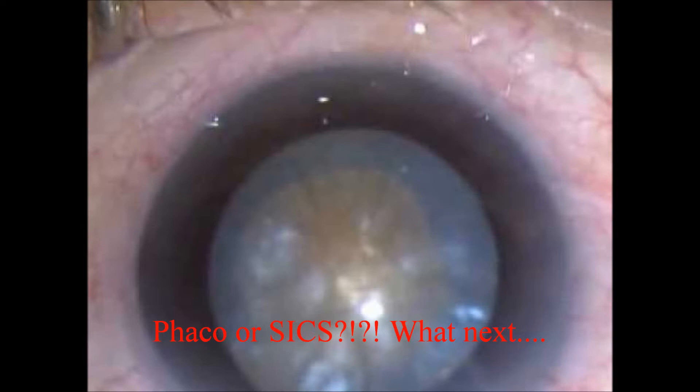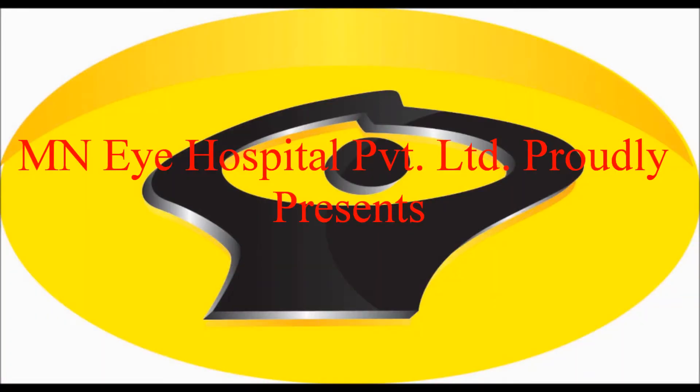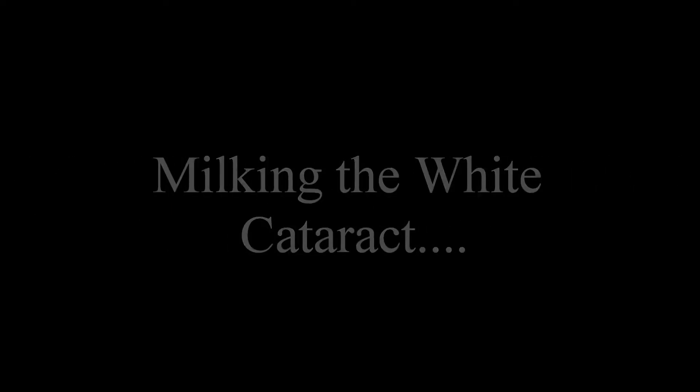Mature cataracts are still a common sight in our population, and these scenarios can happen to any of us despite our experience. Hence, we at M&I Hospital decided to show a few case videos to encourage beginners to perform phaco in almost all difficult cataracts. Our incision decides our phaco.